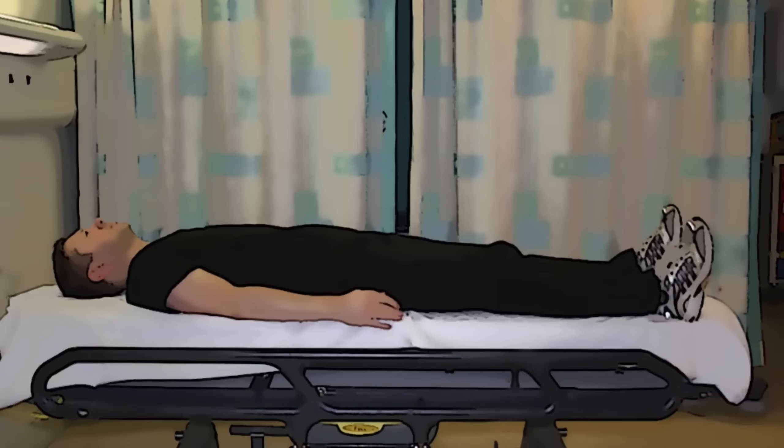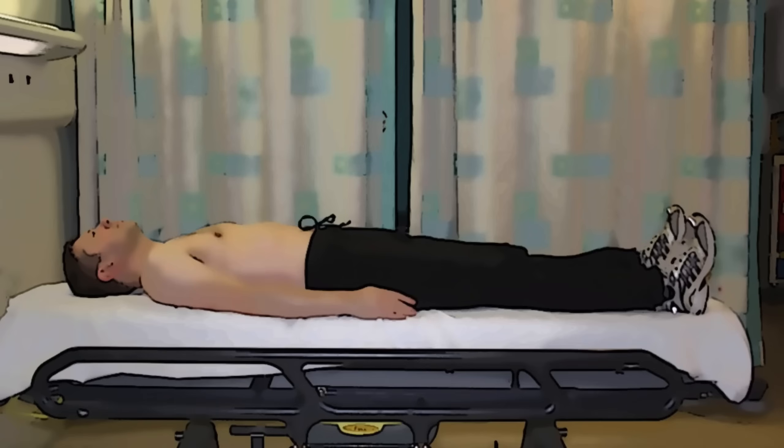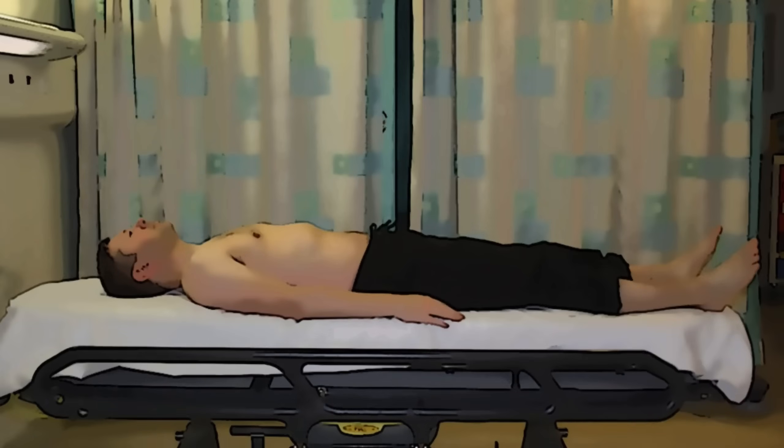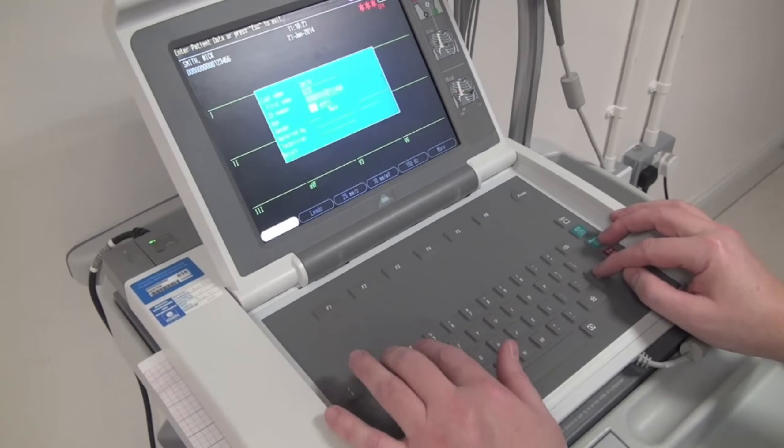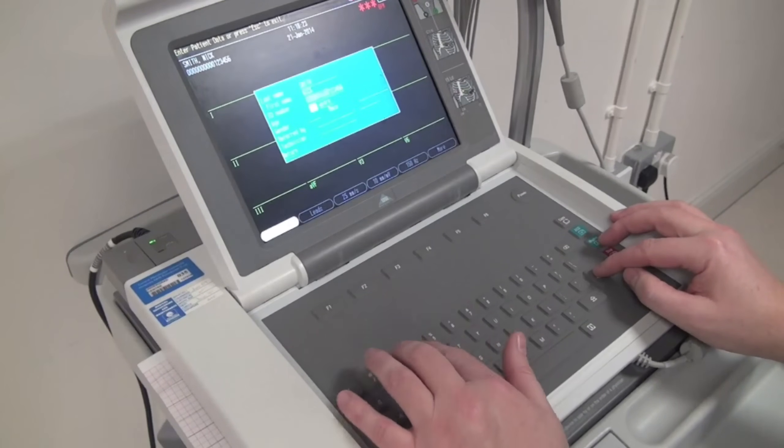Ask your patient to undress from the waist upwards, including bra if necessary. Socks and tights should be rolled down or removed so that you can get at the lower legs. The patient should be positioned where possible flat or in a semi-recumbent position and comfortable. They should remain covered whilst you enter the patient's demographics into the ECG machine.